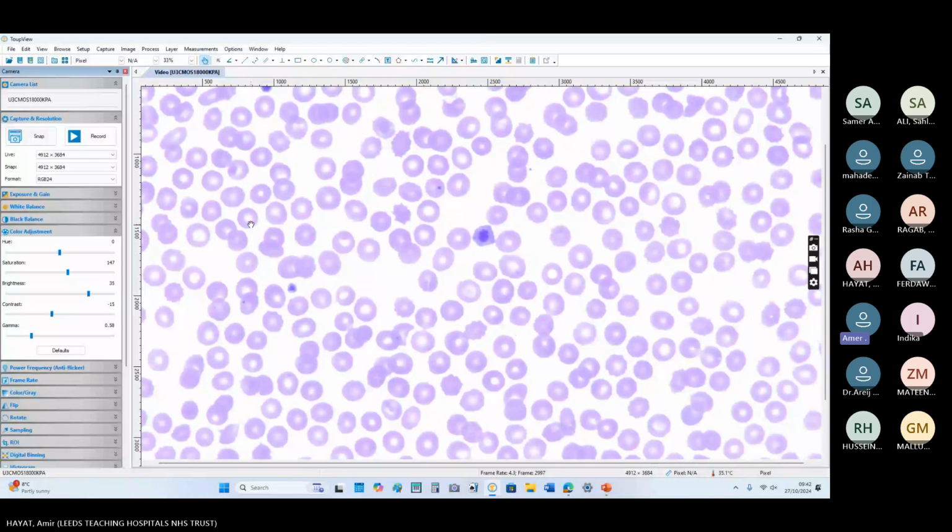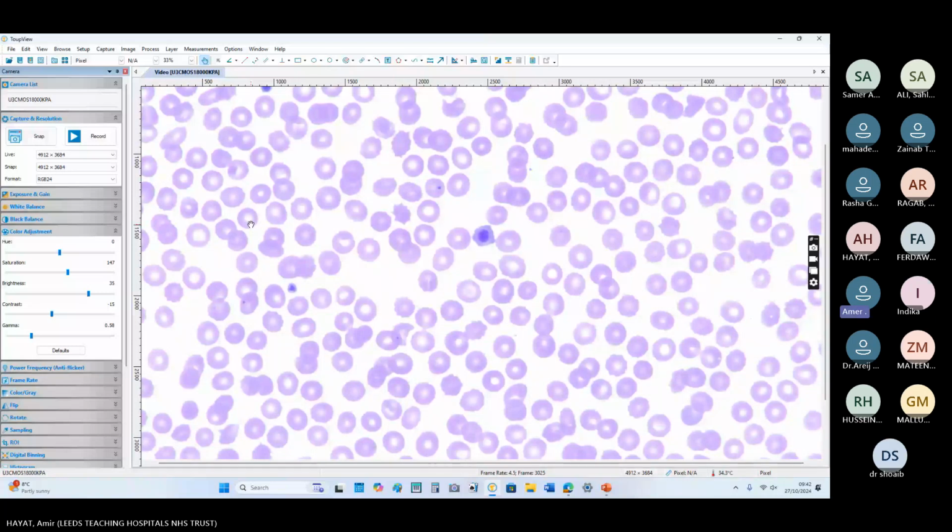So you would say the blood film shows large size platelets or macrothrombocytes. The platelet counts are low in number. You discuss platelets first because the abnormality is in the platelet. So whichever line has the abnormality, you will mention that first. This blood film contains macrothrombocytopenia, no platelet plugs or clumps seen. White cell morphology is normal. Red cell morphology shows few echinocytes, which can be an EDTA effect.